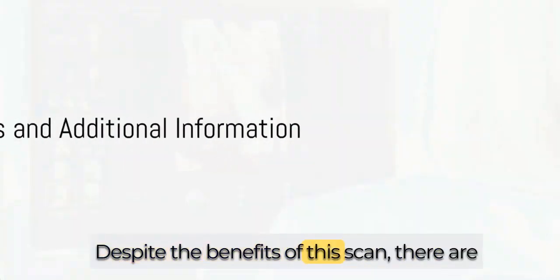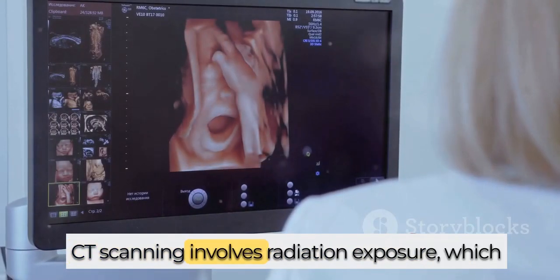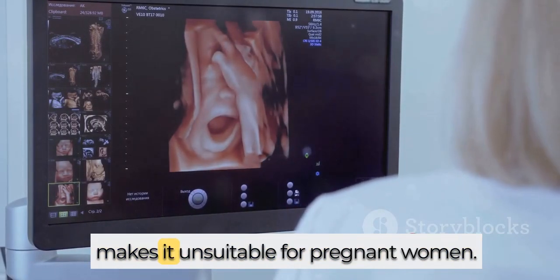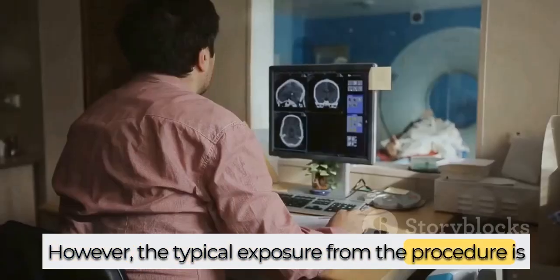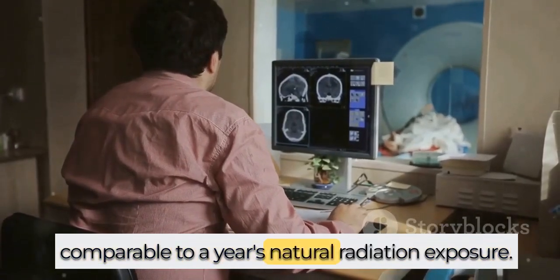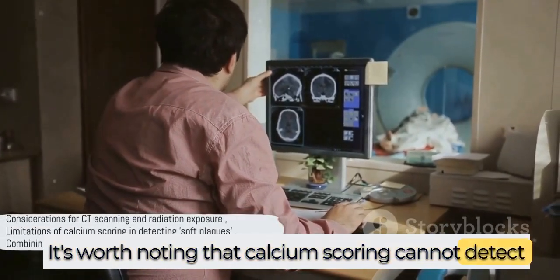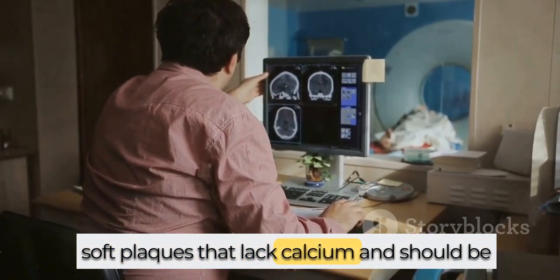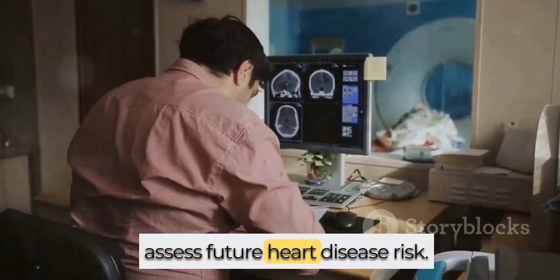Despite the benefits of this scan, there are a few considerations to keep in mind. CT scanning involves radiation exposure, which makes it unsuitable for pregnant women. However, the typical exposure from the procedure is comparable to a year's natural radiation exposure. It's worth noting that calcium scoring cannot detect soft plaques that lack calcium and should be used in combination with other risk factors to assess future heart disease risk.